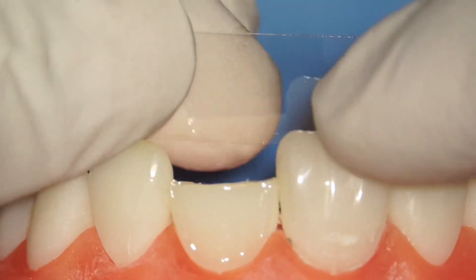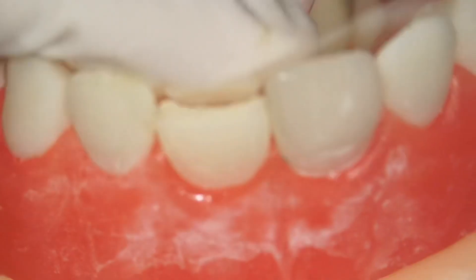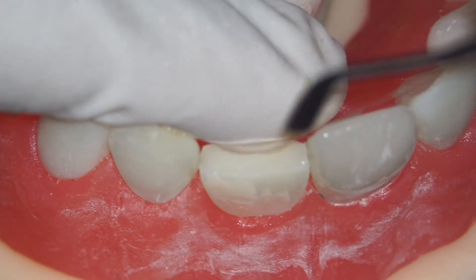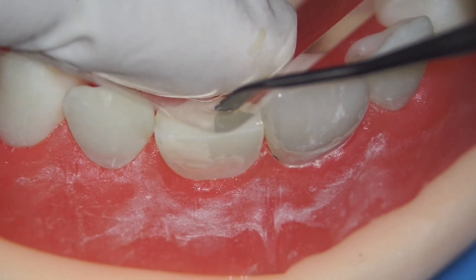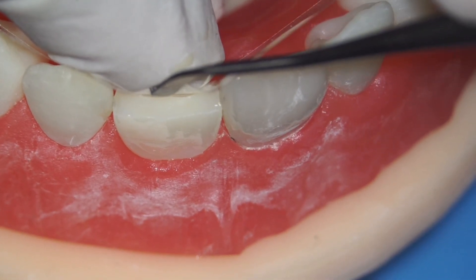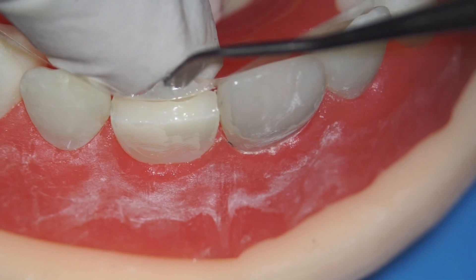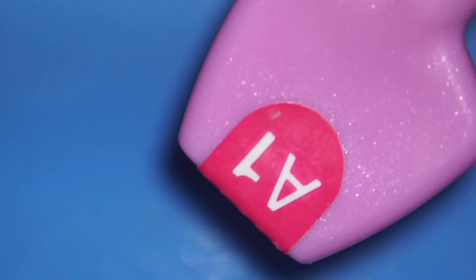We're going to build the palatal wall freehand using a celluloid strip or celluloid matrix. The problem with the freehand technique is that when you press the celluloid strip with your finger it tends to cave in, but you need something with a more natural curve. What we usually do is place the celluloid strip with the finger and use a plastic filling instrument to slightly pull the strip lingually or palatally.